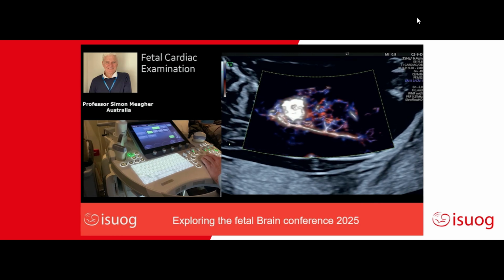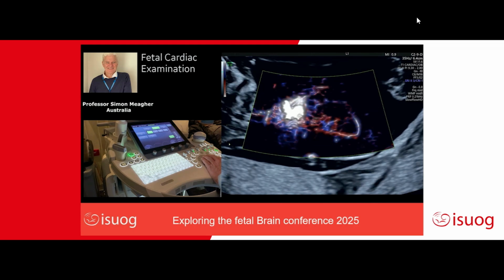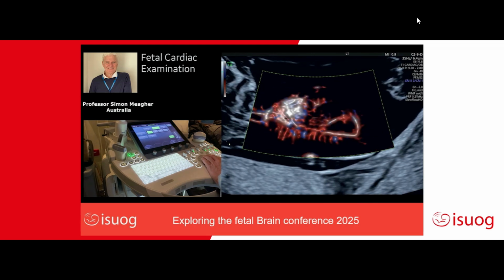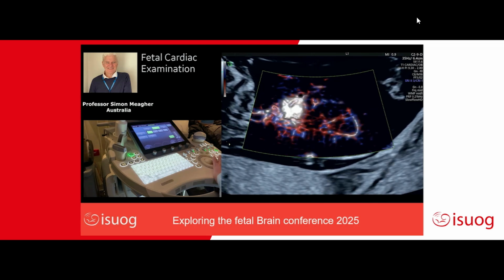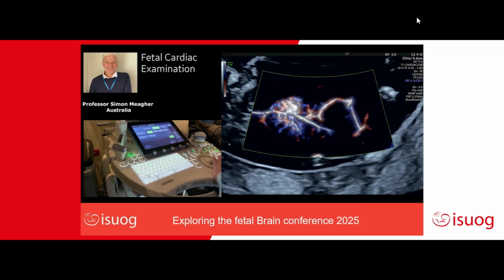So if you can just stop breathing just for a second. 5, 4, 3, 2, 1. And what I was doing there was sweeping from right to left side.